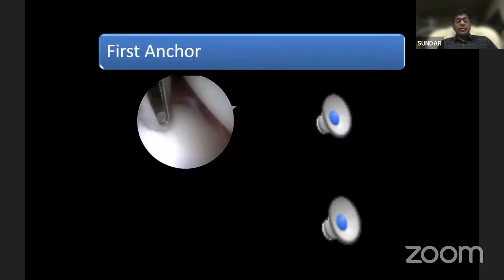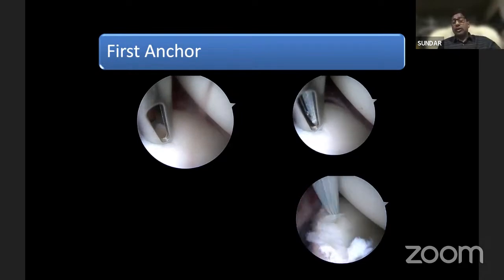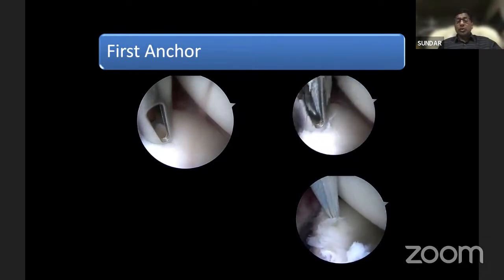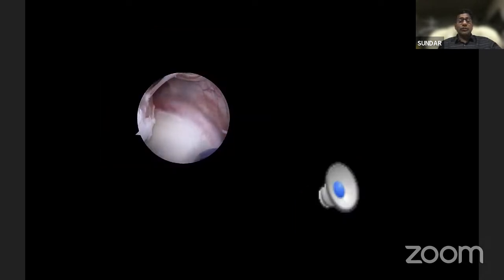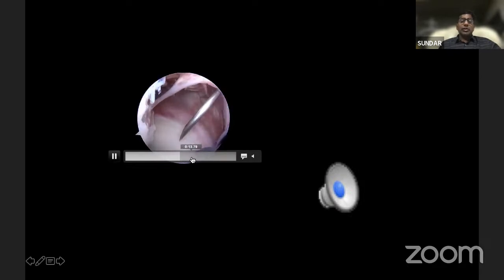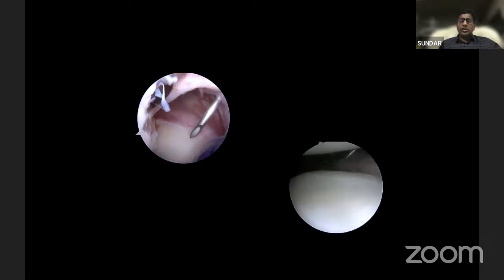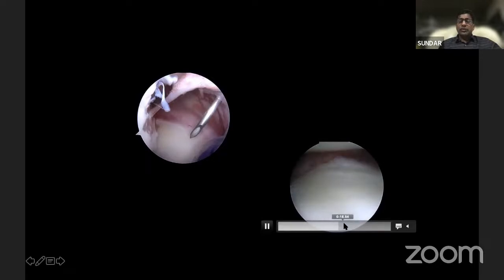So once you've done that preparation, you can use double loaded anchors. I always prefer to use double loaded anchors at almost the 5 o'clock or 5:30 position. Because I liberated up to 7 o'clock, I usually prefer to take bites at the 7 o'clock position. Here I usually use the posterolateral portal, but I don't make a cannula, I just make a percutaneous incision, a small nick. Then you bring in your suture lasso device from the opposite side. It is very easy to bring it there and take a bite at 7 o'clock or a 6:30 position.